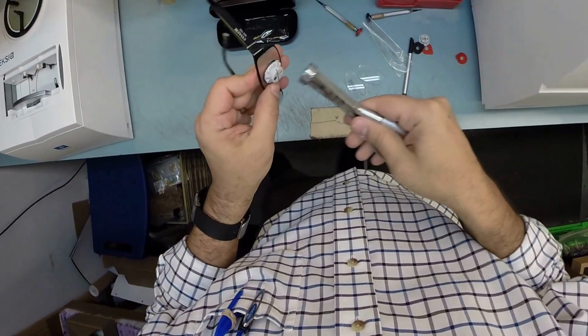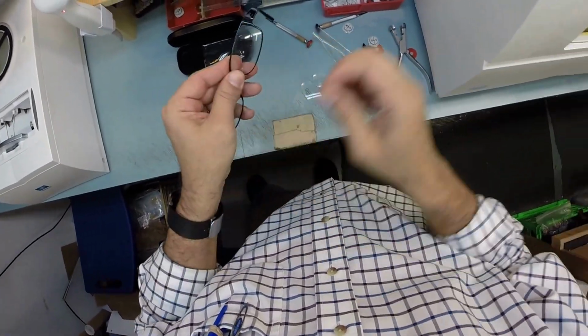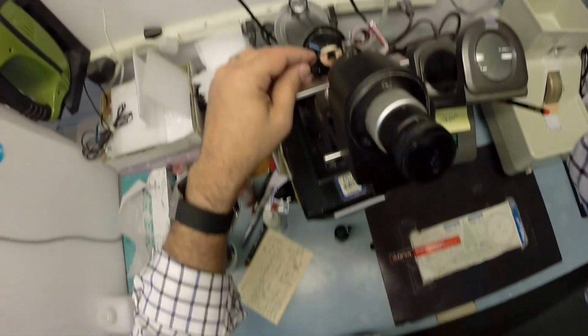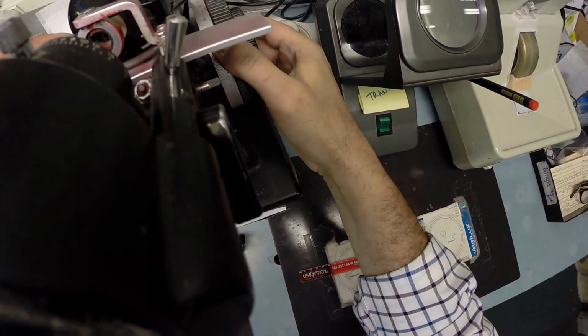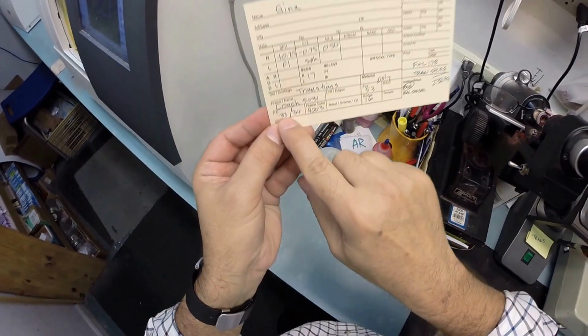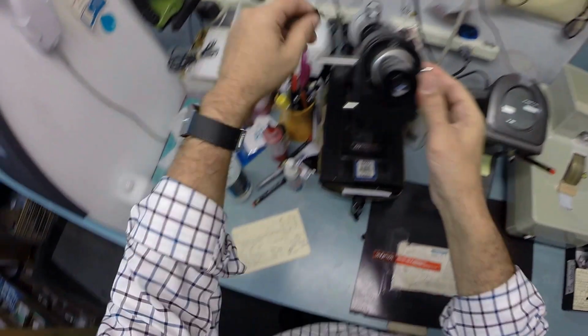That is good. I'm going to go ahead and take this block off. It is no longer needed. Pull the sticker off. That is no longer needed. We're going to come back down here to the lensometer. Check the power. And we're getting 0. No power whatsoever. 20/20. Now your pupillary distance in your right eye is 33, 34 in the left, for a total of 67. I'm going to take this out.